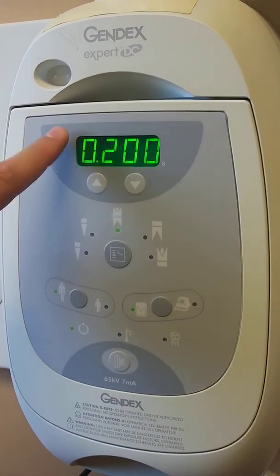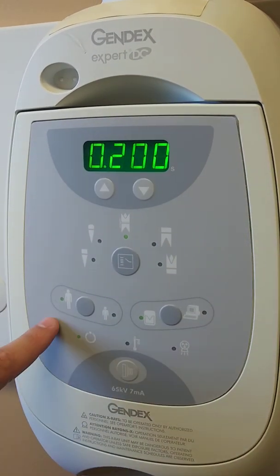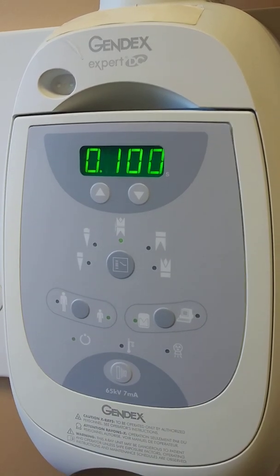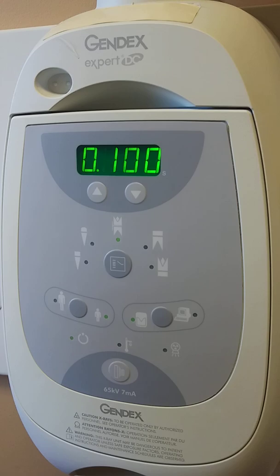Over here, you can adjust it from an adult to a child. If we're taking a bite wing on an adult, it's 0.2. If we adjust that to a child, you'll notice it drops down to 0.1. It takes a lot less radiation energy to produce a quality image for a child than it does for an adult.